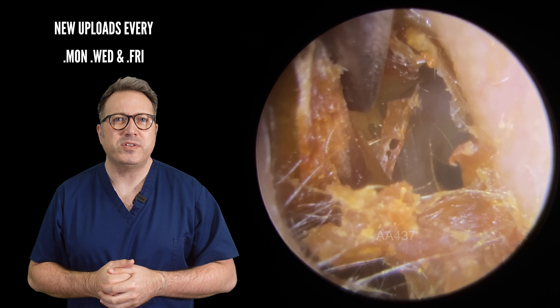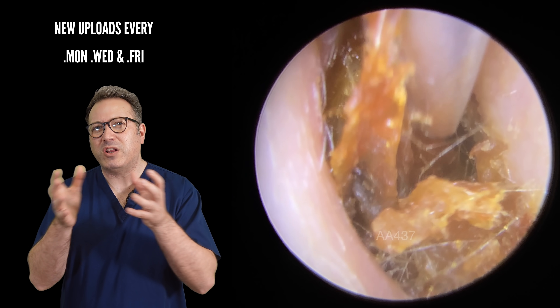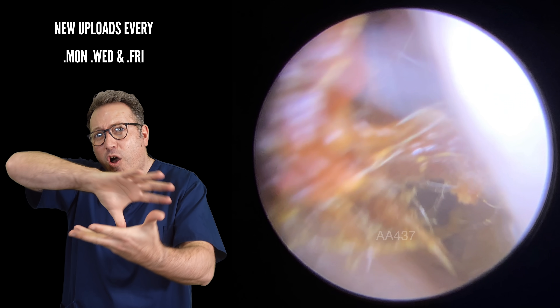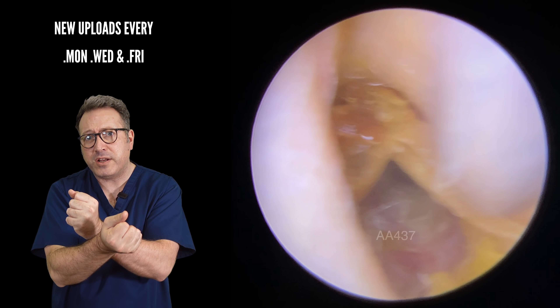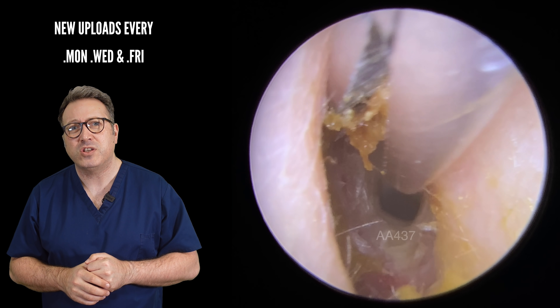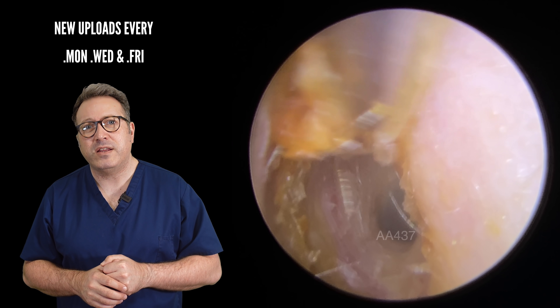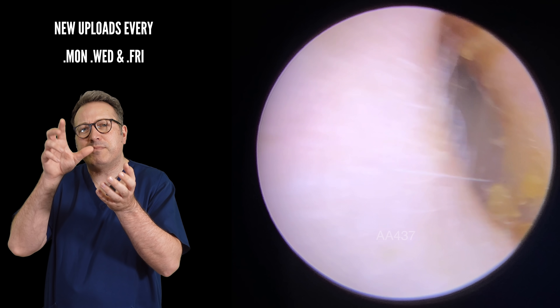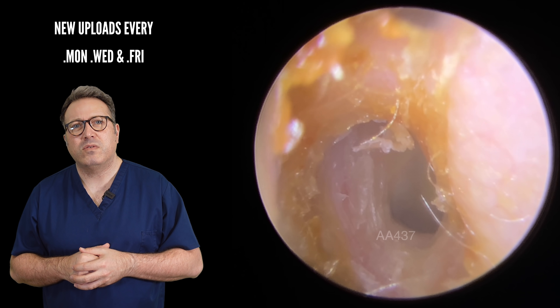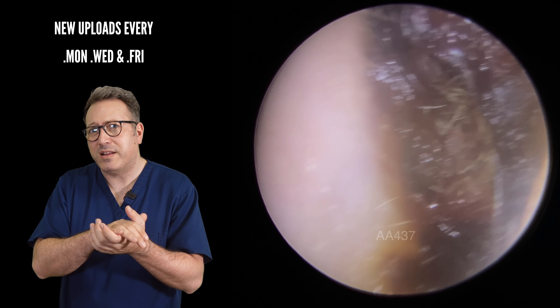We've got the crocodile forceps in here now. Unfortunately my crocodile forceps have quite a wide end — we were struggling to get the thinner end on there. But you can see as we get a good grip, that whole section just kind of unpeels from around the outside edge, drawing all that with it. We're trying to get a good grip on the top section, draw it forwards, get a better clamp on the second attempt — it really doesn't want to come away easily. There we go, we've got that little piece away. You can actually see where the dry skin has come away from the canal wall.